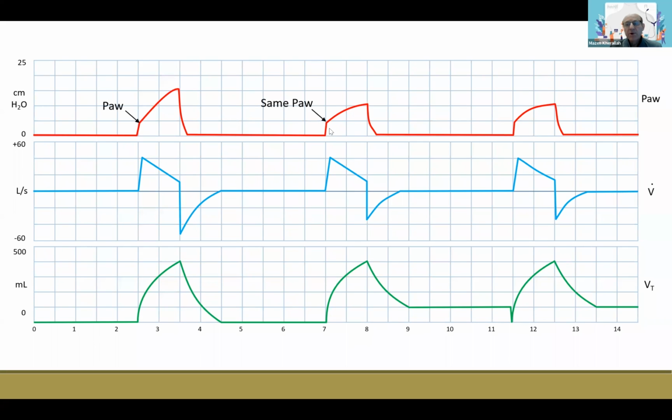And then the pressure goes up to the peak inspiratory pressure. And you can notice that there is a decrease in the peak inspiratory pressure. That's because you're losing air in the system. And this is actually for bronchopleural fistula. There is no problem with the airways here because you're losing air into the chest cavity.